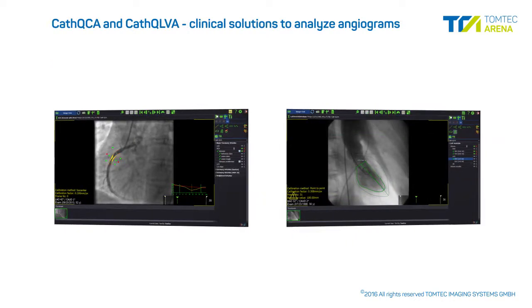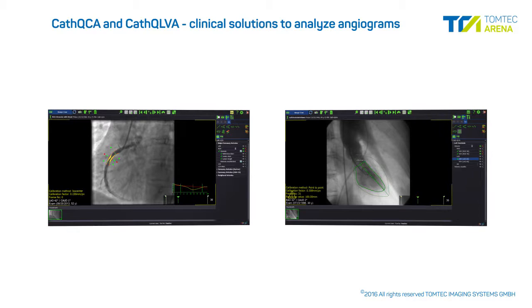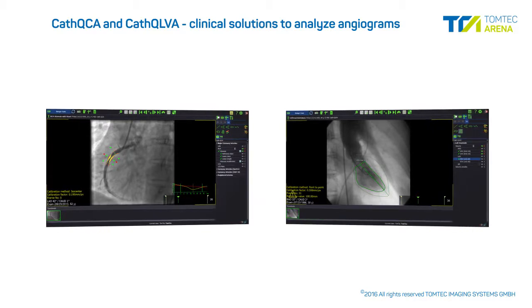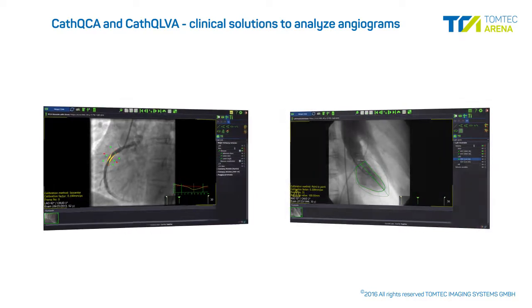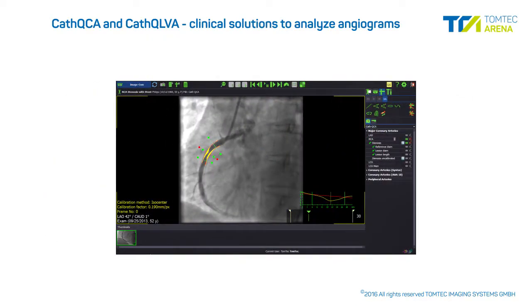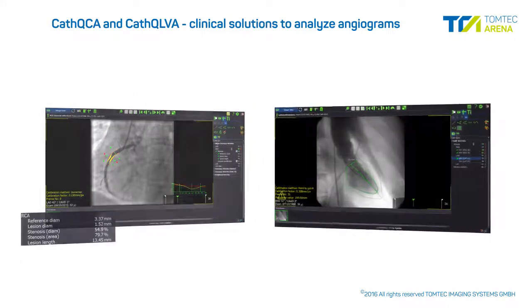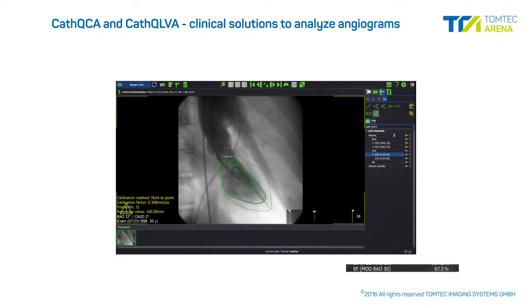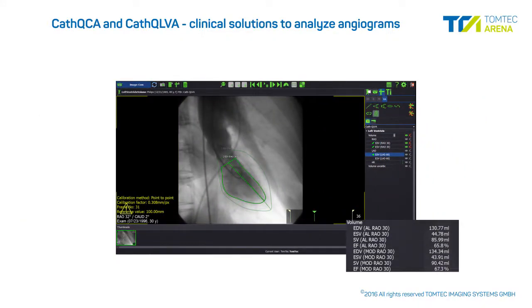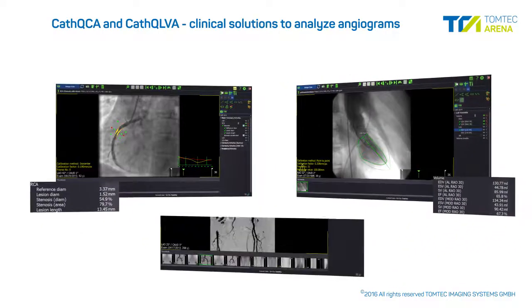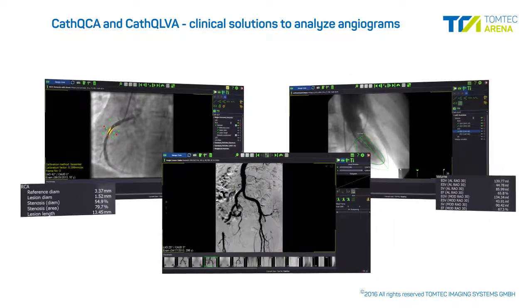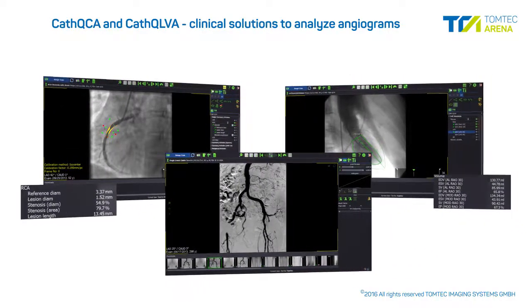CathQCA and CathLVA are integrated clinical solutions to analyze angiograms. The vessel wall of obstructed coronary arteries is automatically detected to perform comprehensive stenosis quantifications. Left ventricular volumes and function are calculated based on a tracing of endocardial borders. ImageCom also provides digital subtraction angiography for peripheral vessels.